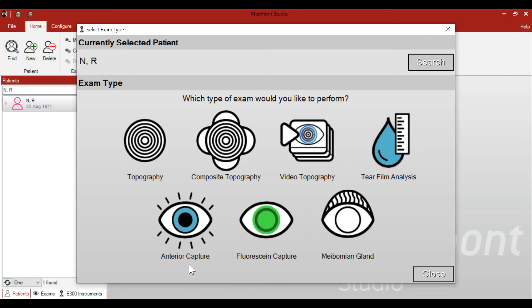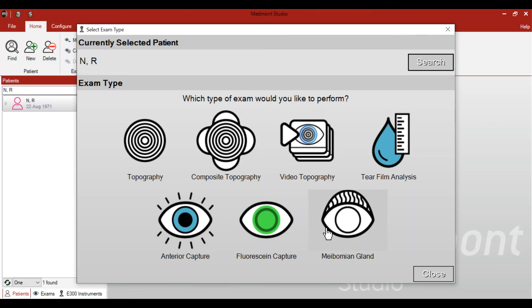The bottom three tests are more photography or image oriented. An anterior capture is similar to the white light photography you might do with your slit lamp. The fluorescein capture is similar to the cobalt capture with your slit lamp. The meibomian gland imaging uses infrared to assess the meibomian glands of the upper and lower lids. Each test uses a similar platform and similar control of camera settings, illumination, and options — really only changing the light source: white light, blue light, or infrared light.